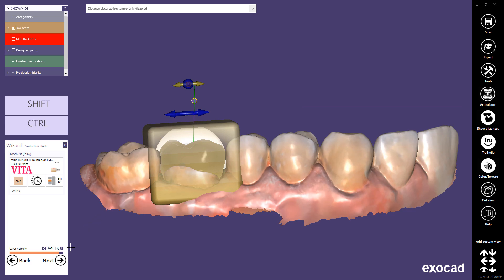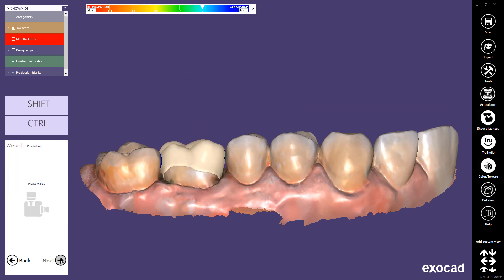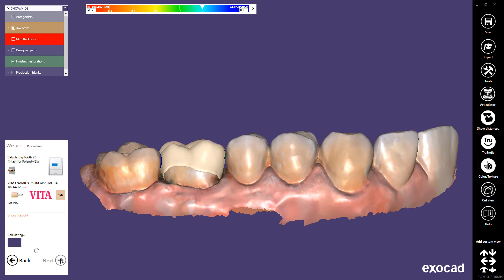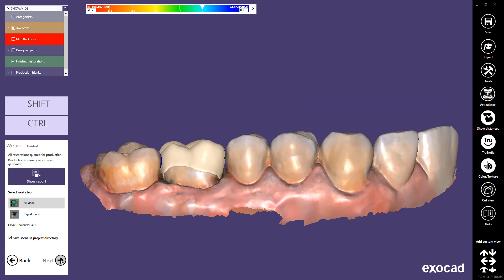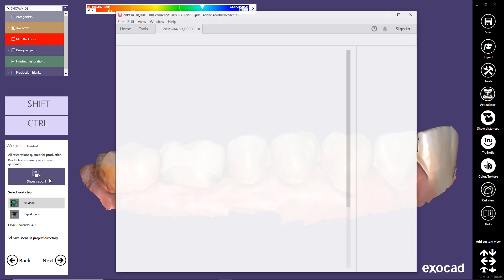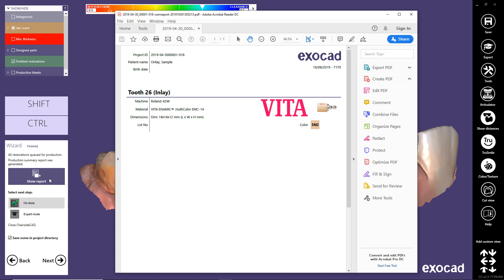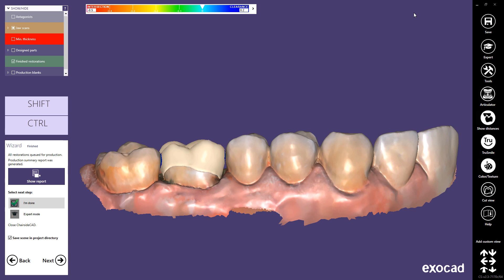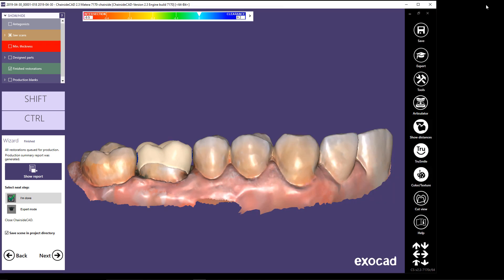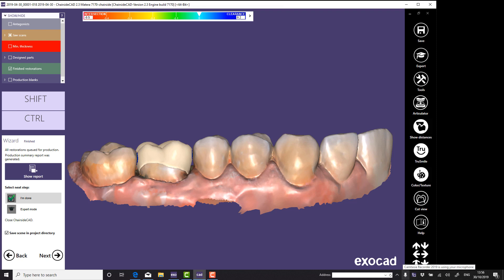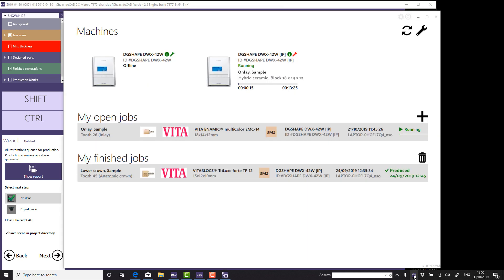Click Next to initiate the production step. Once the toolpath calculation is complete, the Chairside CAD workflow is finished. The restorations you have created are queued for production and a PDF file containing the production summary report is generated. Machine Tray tool is a software application for storing, scheduling, displaying, and transferring dental CAM jobs. A longer and more comprehensive tutorial is available in a separate video.